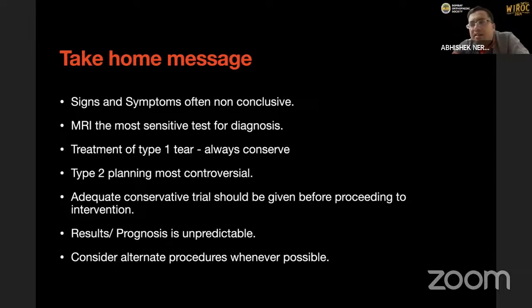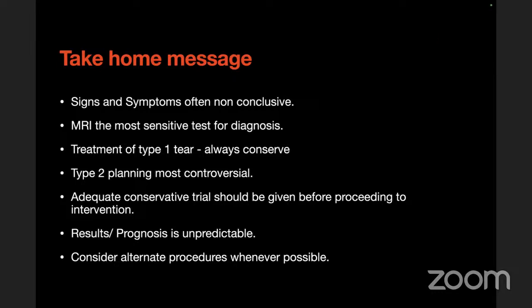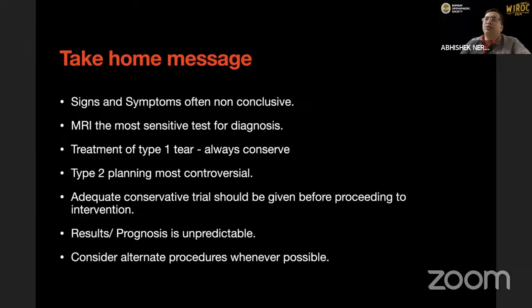So bucket handle, especially type 3, you just have to excise the bucket handle. That's it, and it will stop the symptoms. I try to carefully look at MRIs to find these buckets. Maybe I've seen one or two where there was a real bucket. So do you see them on the console, or are you able to find them on the MRI films?